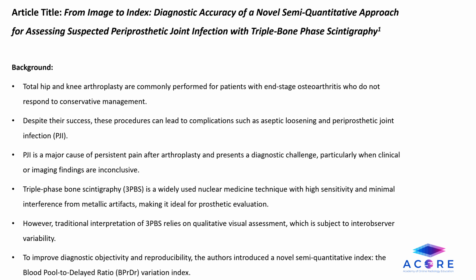So my article title is From Image to Index, Diagnostic Accuracy of a Novel Semi-Quantitative Approach for Assessing Suspected Periprosthetic Joint Infections with Triple Phase Bone Scintigraphy.